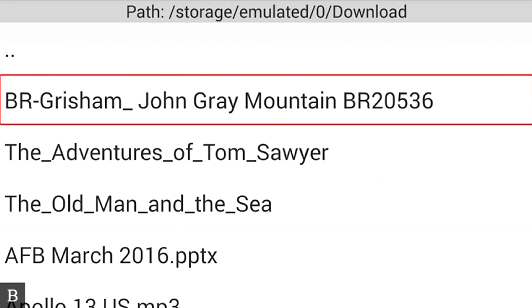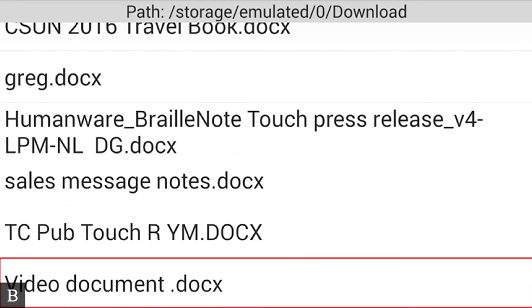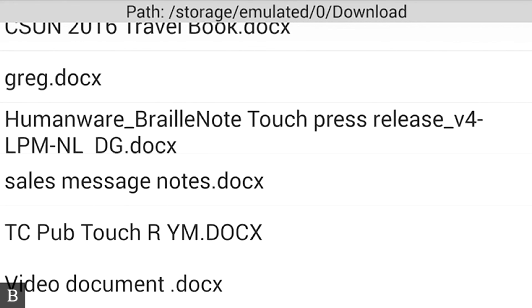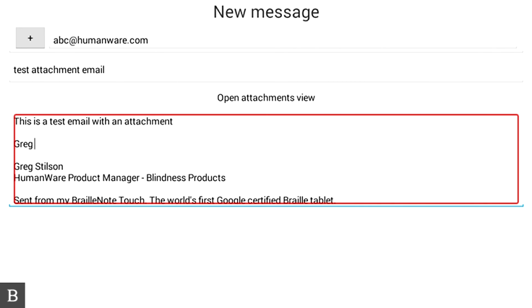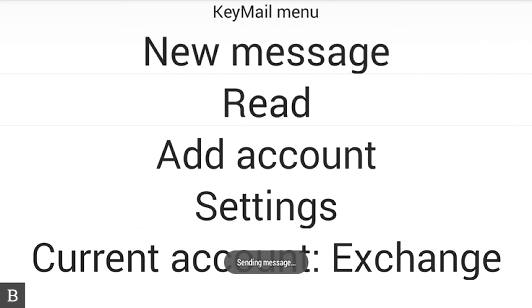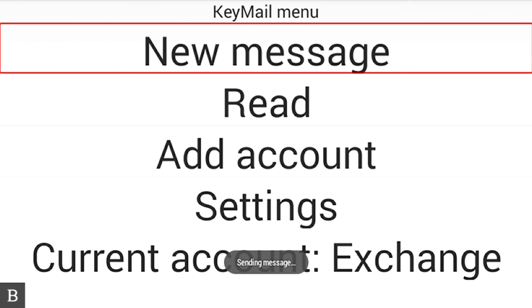Key Files — HumanWare's file browser — opens. I'm going to press V to go straight to the Videos option. I see Video Document, a .docx file. I'm going to press Enter to select it. Keymail has now attached the Video Document to this email. I can press Backspace+S to send the message. It's that simple to send an email with an attachment.